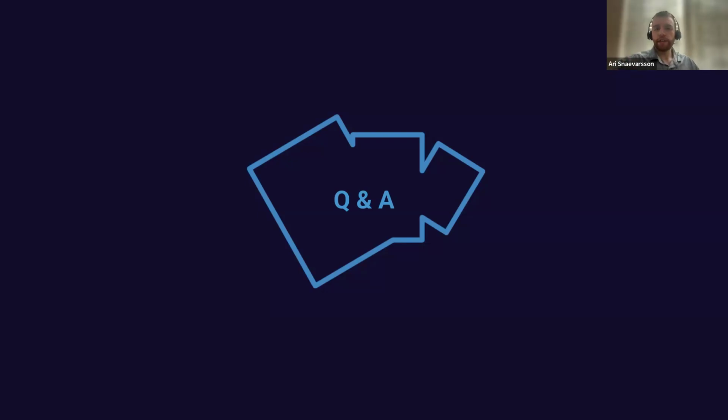Great. This other question here is, does the system have the ability to remove all identifying data from a study? And the context is, I've had to create a few double-blind studies for experts to see if they properly identify issues while not knowing which image is related to the case. That can be very difficult. What are your thoughts on that, Les? Sorry, you're going to have to say that one again. I lost track of that.